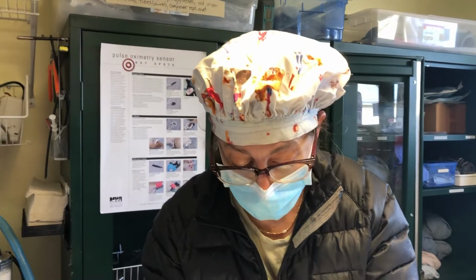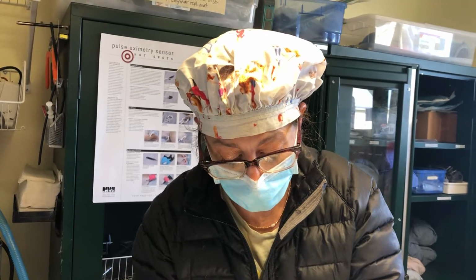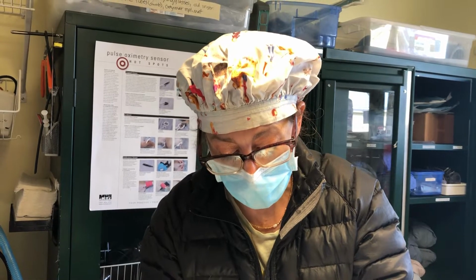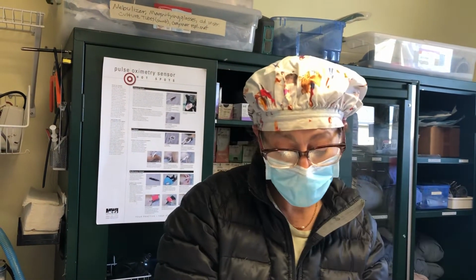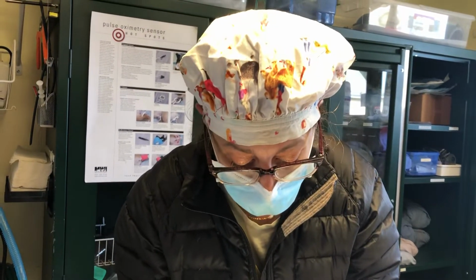This is an indoor-outdoor middle-aged cat. He has had a chronic, recurring, well, twice now, abscess. So the first time we put him on antibiotic and sent him home, and then it went down and it came back. And we see a lot of this in indoor-outdoor cats. So this time we're placing a drain.